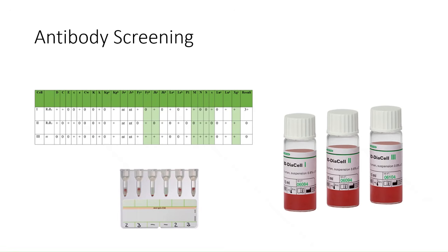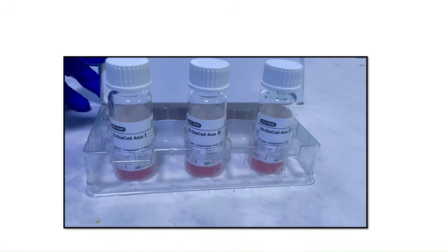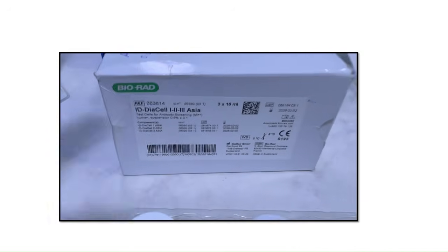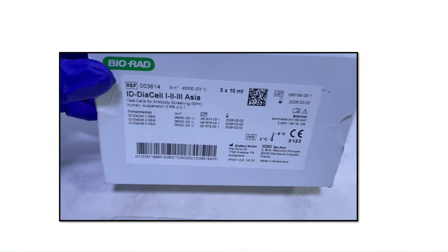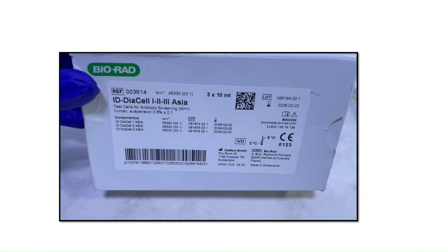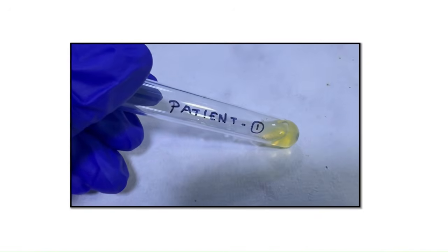Today I will be demonstrating how to perform the antibody screening and identification using the column agglutination technology using commercially prepared reagent red cells. I have taken Bio-Rad's ID-Diacell 3-cell panel. Cells are checked for color change, hemolysis, batch number, lot number, expiry, etc. This is the patient serum to be tested.